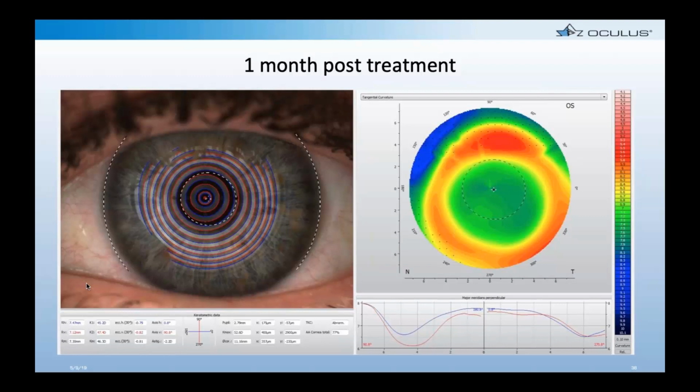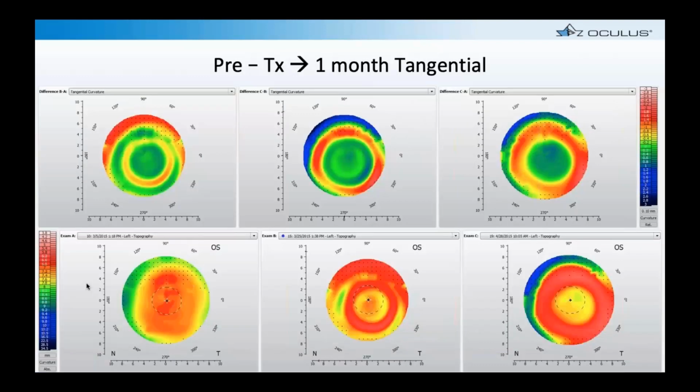And so again, what we can do is look at our comparative maps, and this map here is actually showing the same thing as our previous compare 3s, but it's this newer software that now gives us 3 maps across the top instead of just 2.